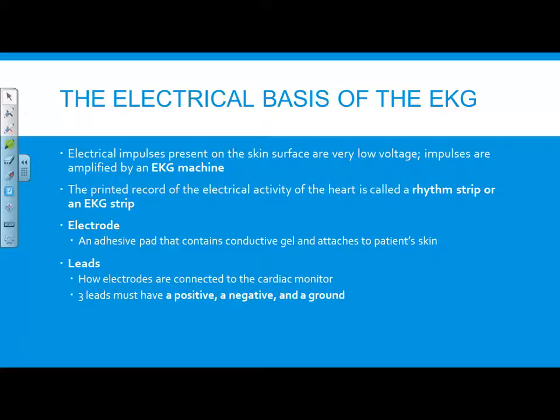Now, because the heart generates very low voltage, the electrodes take that and they amplify it through the cardiac machine. Electrodes and leads, I think we should have a pretty good understanding of that, but when we talk about leads, we'll talk about leads as positive, negative, and the ground. All right, when we get to leads, there are going to be different lead views based off of the way that it's going towards the positive or the negative electrode. So that's where we say leads. Leads doesn't necessarily just mean the plastic stick or the sticky that we put on the chest. Okay?